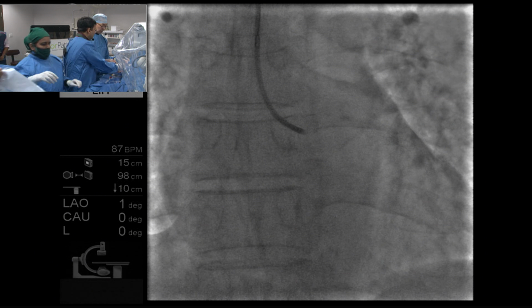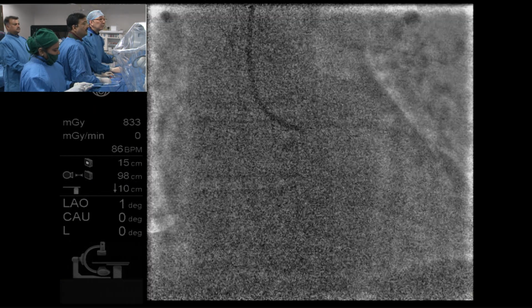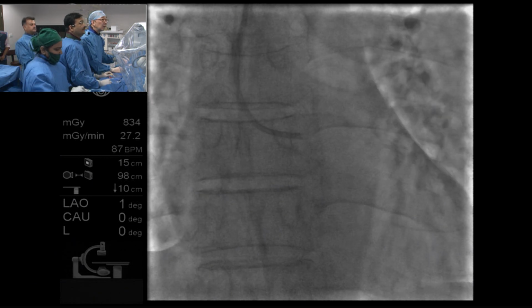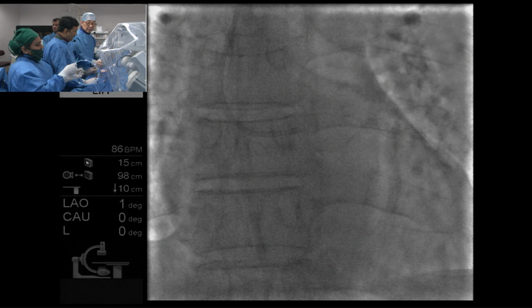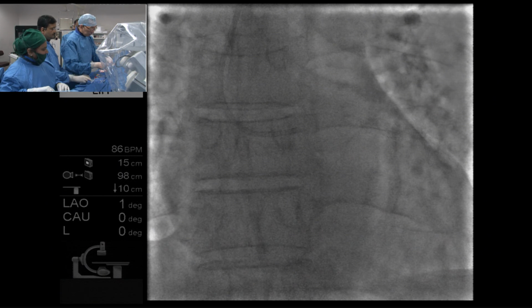Little backflow. No backflow because it's touching the wall. Okay, it's fine. But this one can be AR, can be AL. But I'm using the EBU. Have you had any luck going down or not?